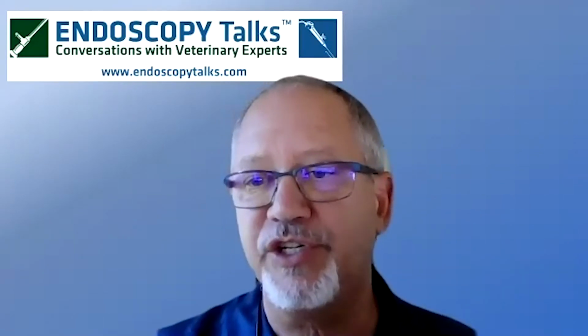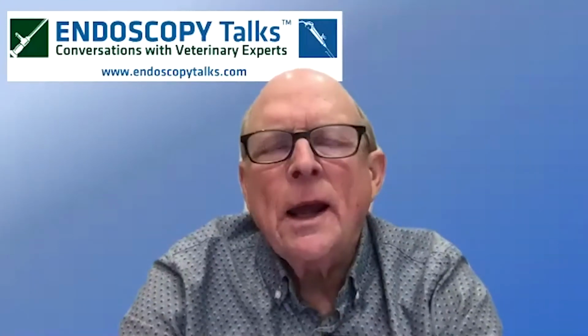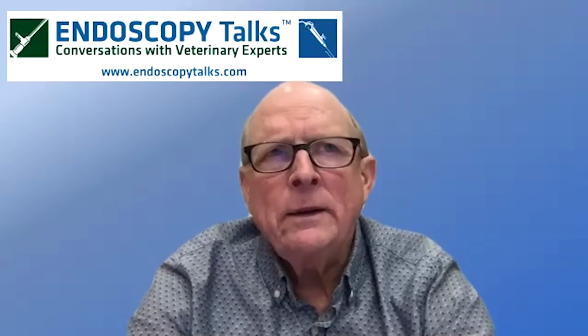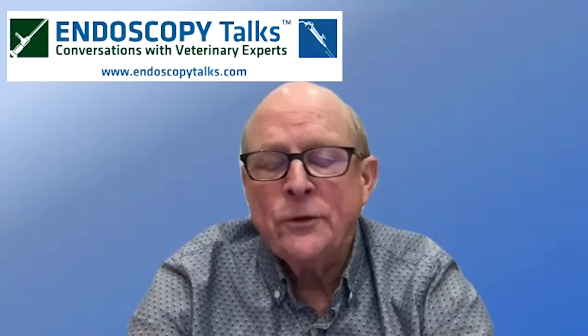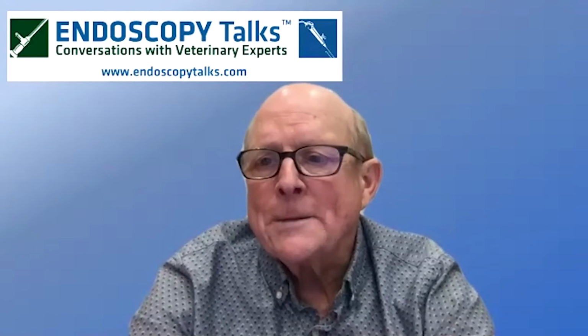Okay. Next question, Dave. Do you try to fast your patients first, or do you go in right away? Food in the stomach is really difficult to find foreign bodies. And if I have a foreign body that's in the stomach and a stomach full of food, and I don't think that foreign body is going to pass on down and cause a small intestinal obstruction, or that foreign body is, such that maybe it's a needle on a thread or things such as that, which I might go for, I might just wait for 12 to 24 hours, till the next day for the stomach to empty to go down and be able to get the foreign body.